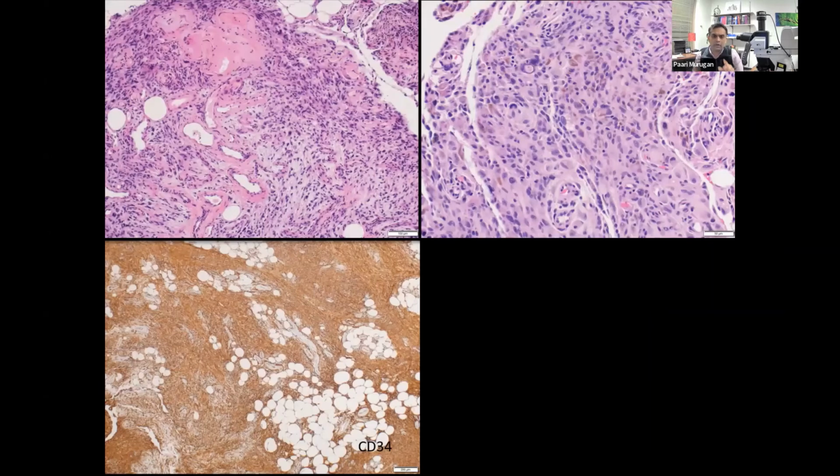That's very important. So morphologically, if you just start naming what you see, that's going to make the diagnosis in the tumor. So we have these ectatic vessels with hyalinized wall. And then we have these pleomorphic cells without any mitotic activity. And then we have a diffuse intense CD34 positivity. So with these characteristic features in mind, an additional ancillary test was done.